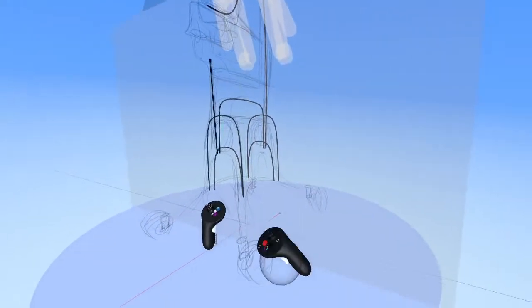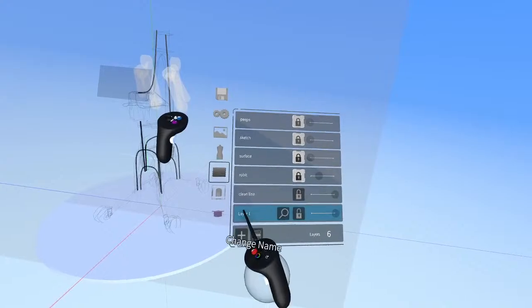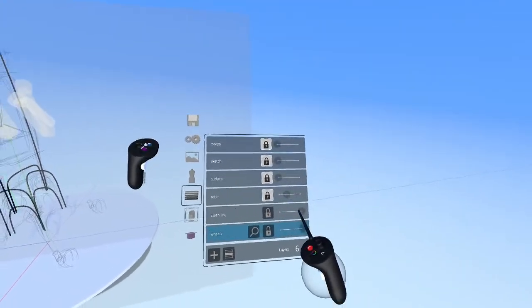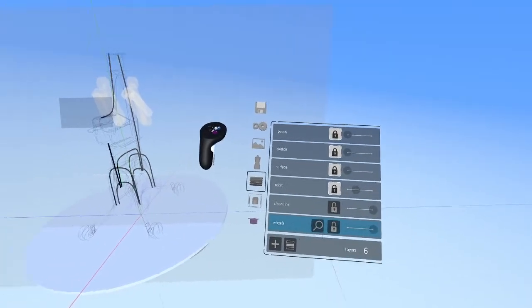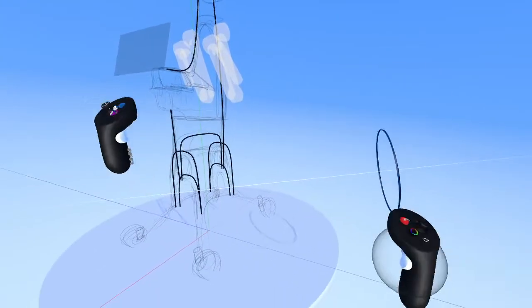Okay, let's make some wheels as well. So before we finish our line drawing, I'm going to make some wheels. Let's create a new layer here, name it wheels. All right, make sure we're active here, and then we're going to start making wheels with the revolve tool. But before we go into the revolve tool, let's check out the questions, see if there's anything.